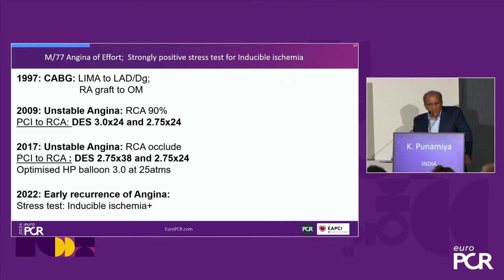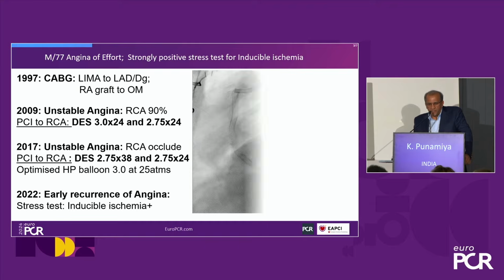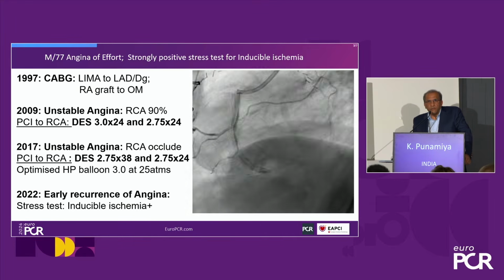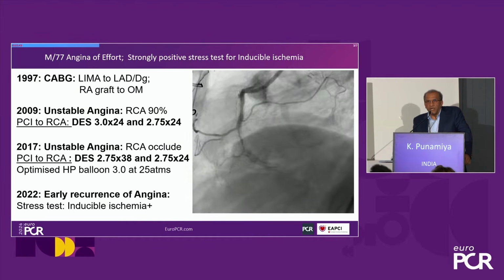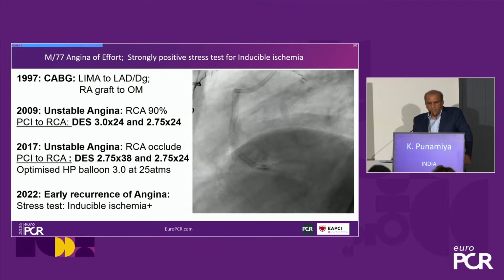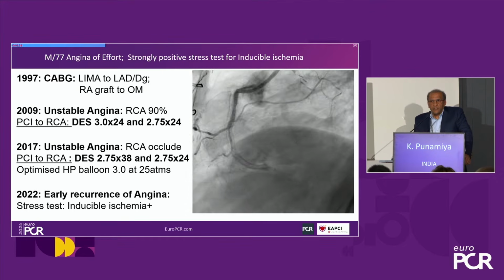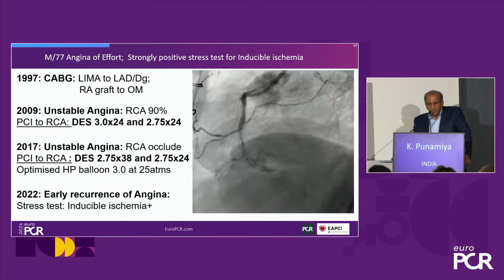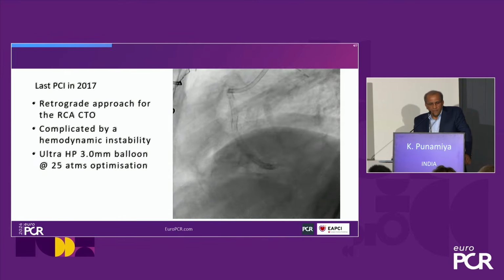He's come with angina, as I mentioned earlier, with a strongly positive stress test, and this is his angio now. So we can see those two multiple layers of stents. We can see unexpanded segments on the fluoroscopy. We see that the RCA is totally occluded after that second RV branch and a long segment missing.